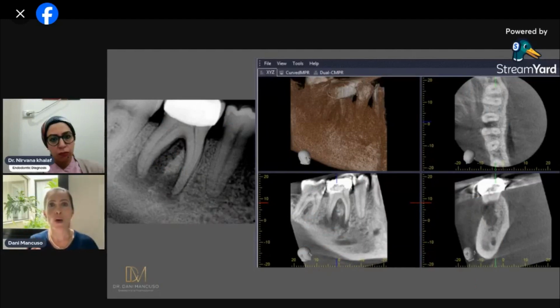Well, this one is the one you probably say, oh, it's fractured. Or most of my students, when they leave the university or they are undergrads, say, oh, it's cracked because it's a J-shaped lesion. It's straight away. However, if you see on the scan, there is a very, very small cortical line over here.